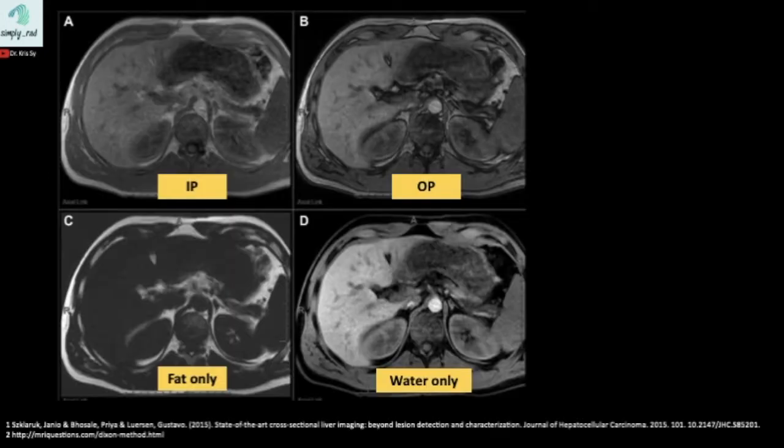We are then given a set of four images just like these, in-phase and out-phase on top, fat only and water only at the bottom. This water only images achieves homogenous fat suppressed images here, which is useful to eliminate the signal from macroscopic fat. Notice here that the subcutaneous fat and peritoneal fat are dark.